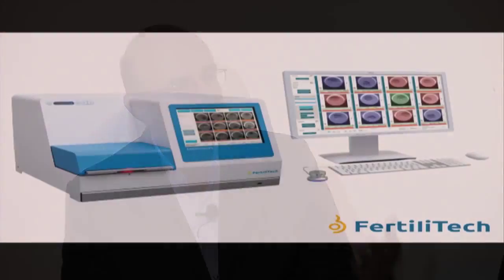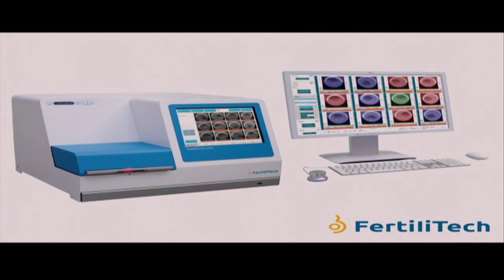And we saw in the previous session, there are other companies that are looking at this technology. But this is a system where you actually have an incubator also, plus the video technology. So on the left-hand side, this is the incubator that actually contains the embryos. And the embryos stay in this incubator for 2, 3, 5 days, depending on when the patient will have a transfer. On the right-hand side, you have this viewer that actually allows you to look at the embryos continually.